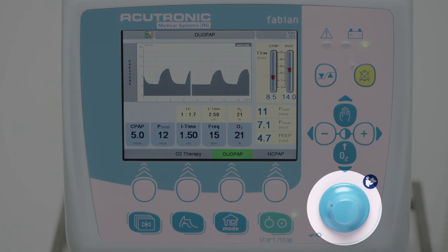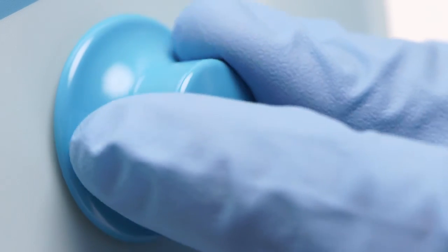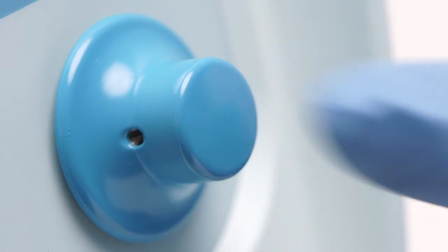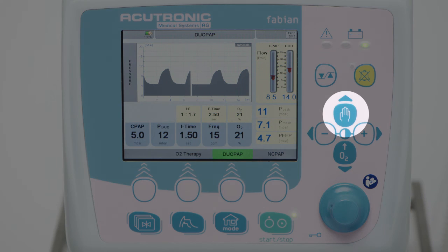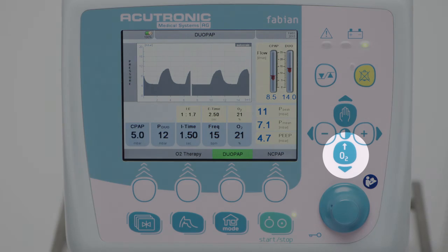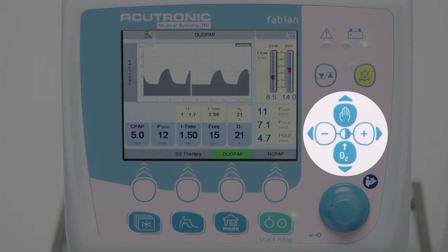The rotary pulse knob combines a push button with a rotary knob for executing various settings, selections, and confirmation options. In addition, the Fabian Therapy Evolution keypad features two rows of buttons. Manual breathing is used to apply a manual breath and is available in all ventilation modes. O2 flush is used to start O2 flush; flush concentration and time can be preset. Cursor buttons serve as controls in several menus.